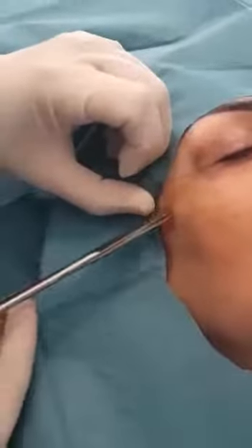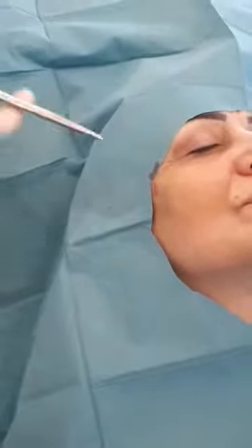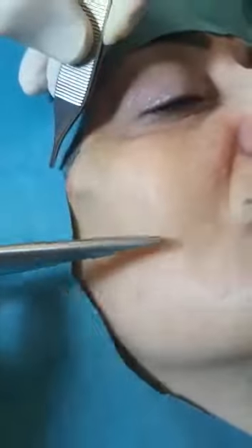You take your scissor. Maybe it's better for you to put some light if you want to take some scissor, forceps. Yes, maybe for you because I don't know if you can see. See when I pull the action?